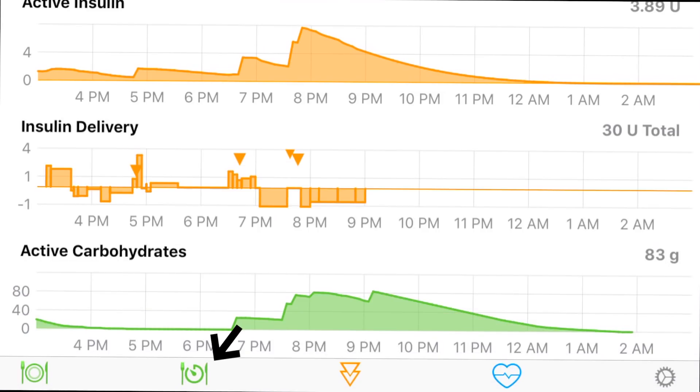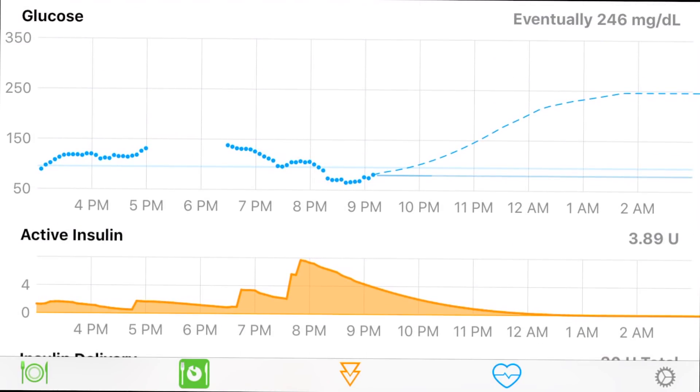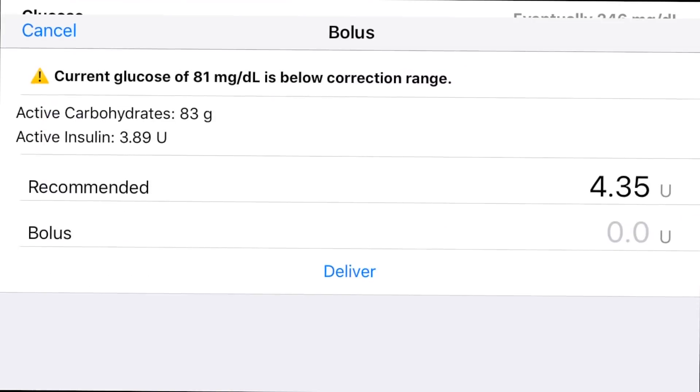We'll cancel this. This button here, when activated, is for preparing yourself for a meal — so you can pre-bolus. You'll see that blue line change. My target is right now at 95, I hit this and it brings it down a little bit, so you could use that before eating. And then this is the bolus — the double down arrows, you just saw that.